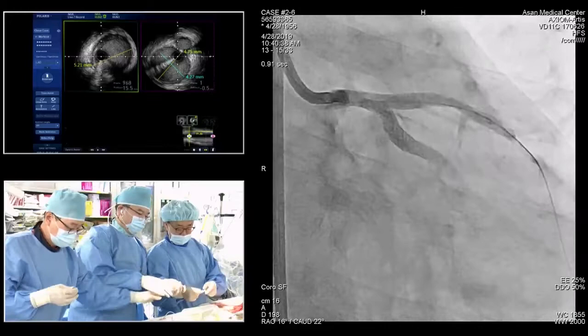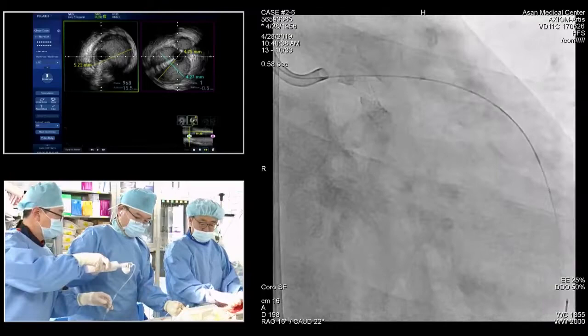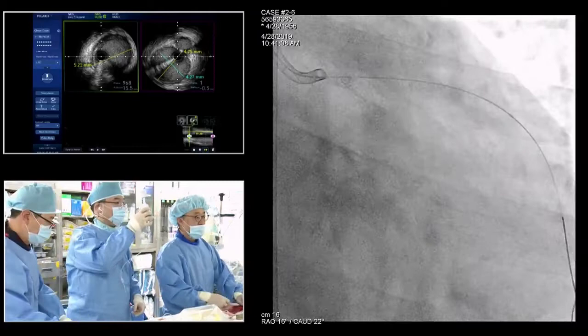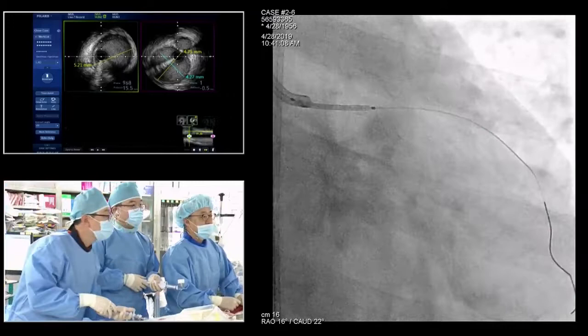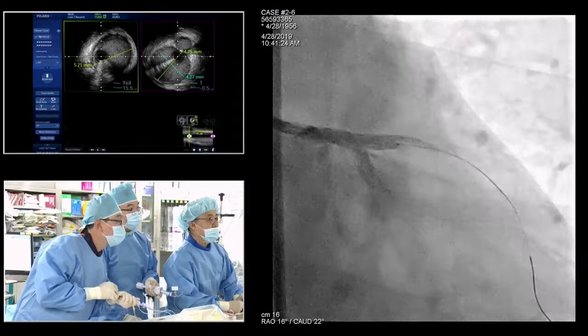There is some dynamic change over time in the crush technique. At the initial time, we did classic crush, balloon crush and DK crush, and there is some change over time. Nowadays, we prefer the balloon crush mostly. Yeah, many people are now doing DK crush. Yes, given the results of some of the randomized trial work, it's more time-consuming. You end up doing two POTs, two crushes, but it does really recreate the geometry of the carina.